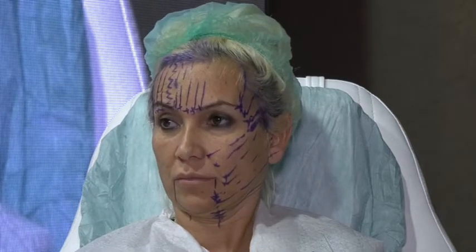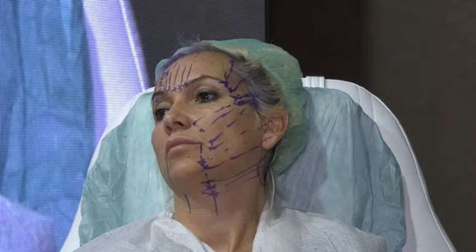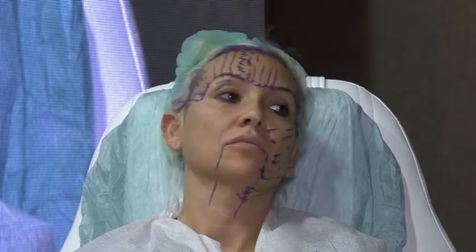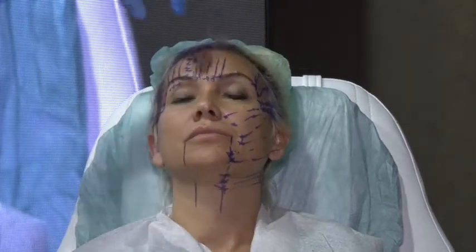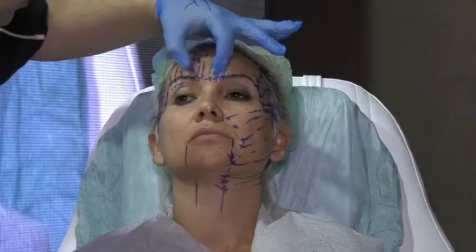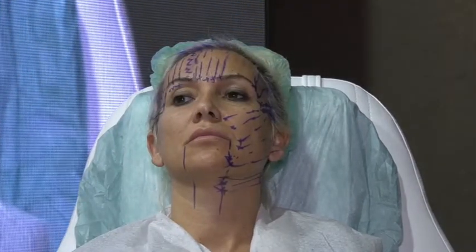No, I mean the marking. I want to finish the whole marking. Maybe I mark and then I can remove it again. Dr. Abdul, can you please help me to remove the marking in the center of the forehead? I want this one only. Okay, this one. I will also do marking of nose and lips on the same model.